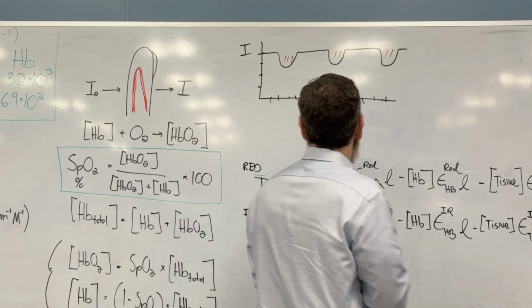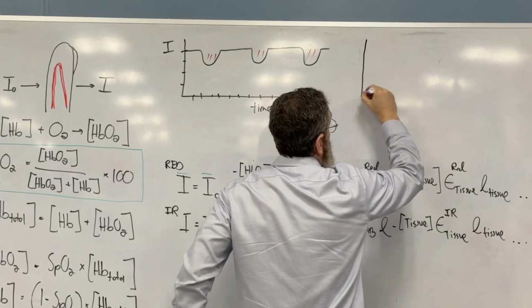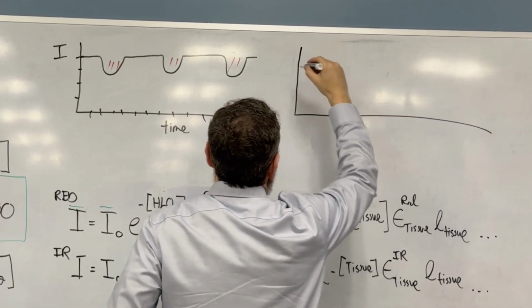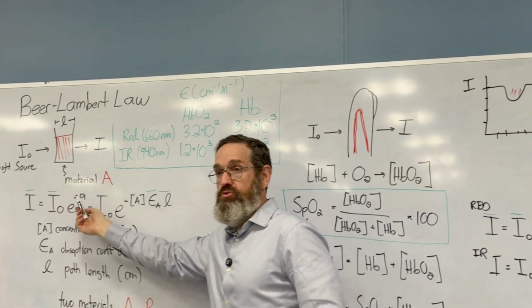Now, I want you to realize that this reflects, I want to label this as A. A is the overall absorption.